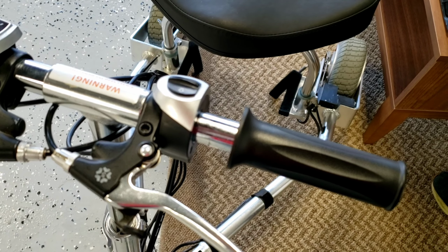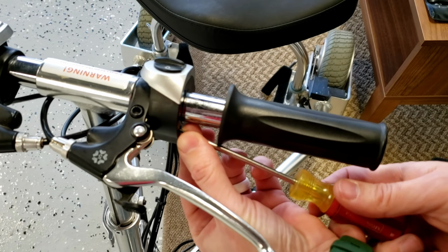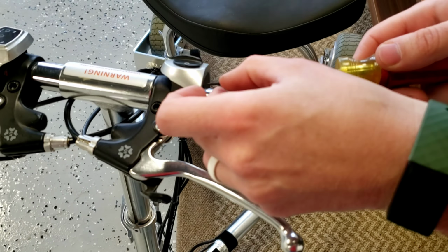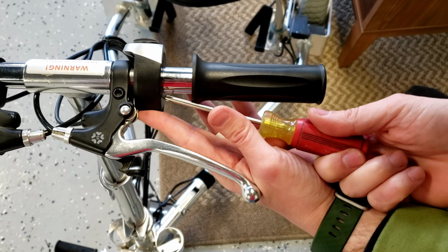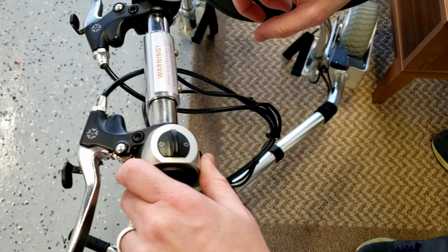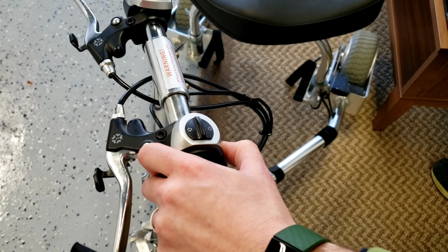And I like to just get them started. You don't have to tighten it all the way at first, just get all of them in there and then tighten down. All right, now that's tight. I'm going to bring everything in. I'm going to align those up so that one's not down or up. We just want to make it look good.